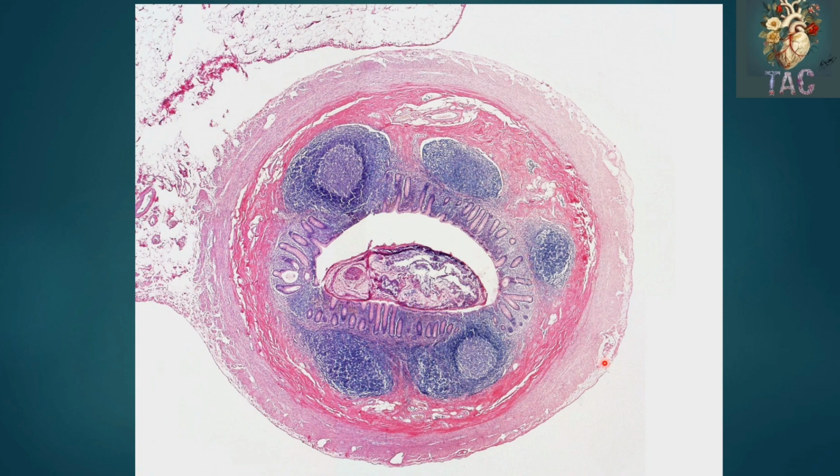Outer to the mucosa is the muscularis externa, which again consists of two layers, the inner circularly arranged and the outer longitudinally arranged, and outer to that is the serosa. Serosa means it is connective tissue covered by peritoneum. So this is the whole diagram of the appendix.